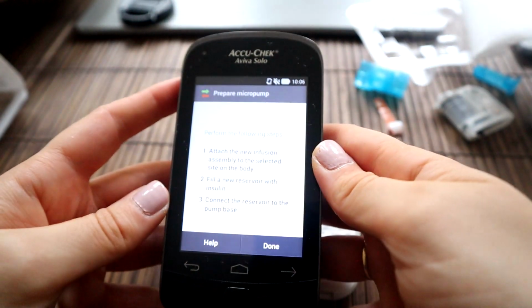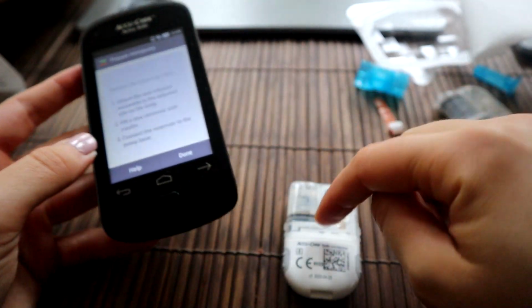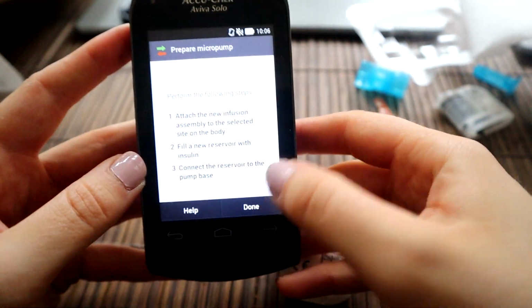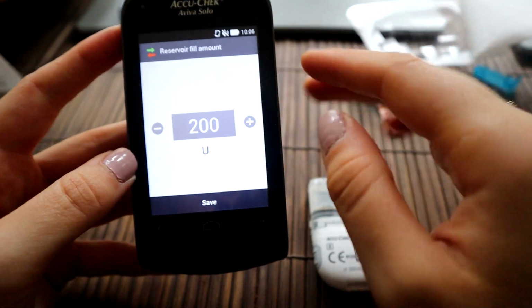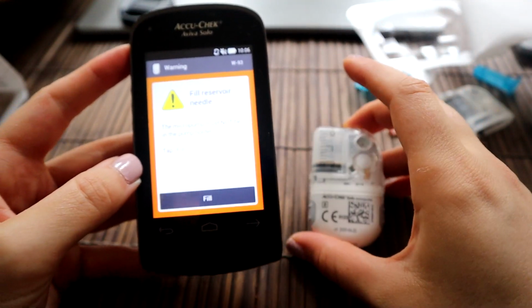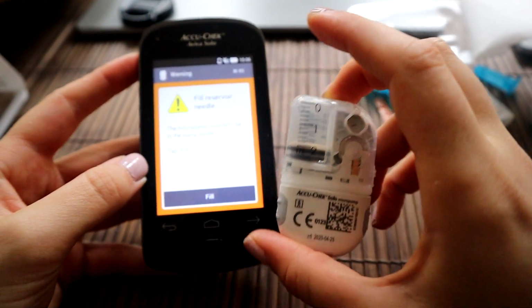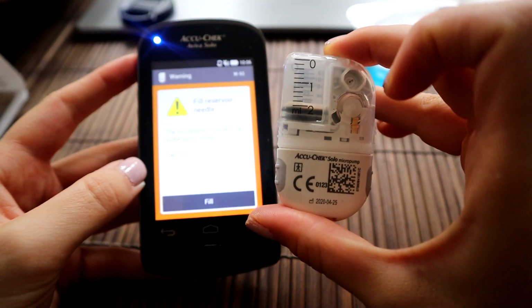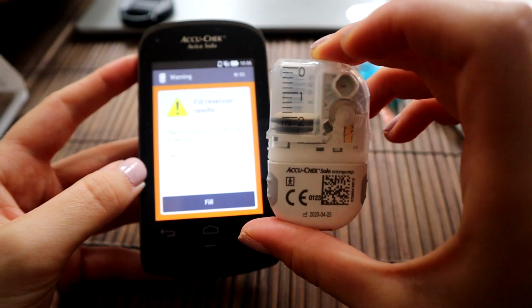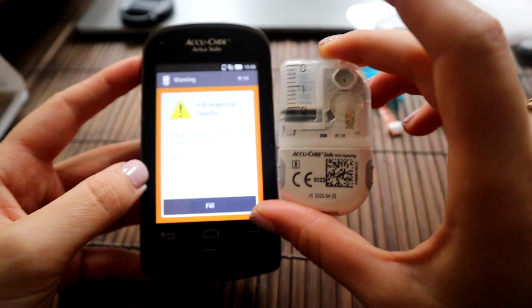So then we can go on here to say connect reservoir to pump base, done. Obviously pump base, new reservoir. Then enter how many units of insulin you put in, save. And now we need to check whether the reservoir is working. So basically you press fill, and it will slowly start putting insulin out, and you just have to watch the needle to check whether any actual insulin comes out.